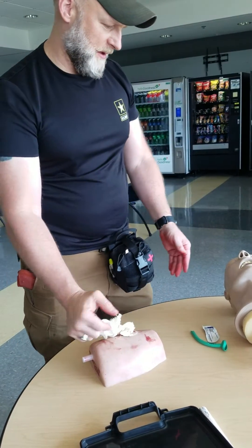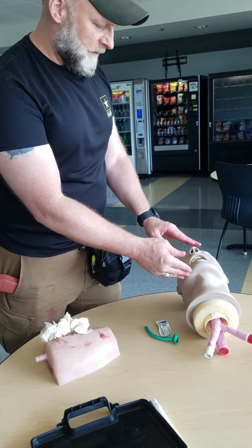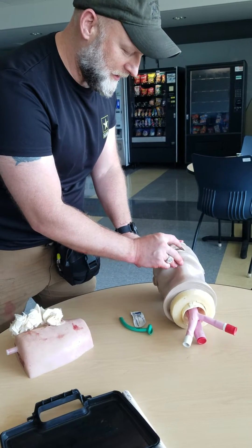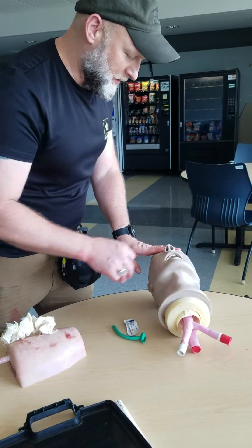Now we're talking about the airway part of the MARCH algorithm. The first thing I do on the airway is the head tilt, chin lift method. I look inside the mouth for any type of obstruction — whether it be the tongue, broken teeth, blood, or vomit — and try to sweep that out.